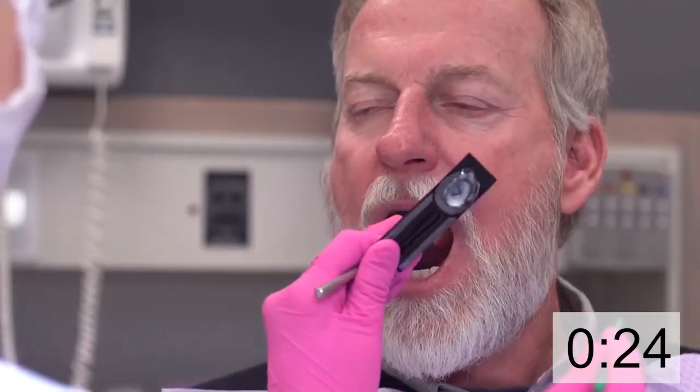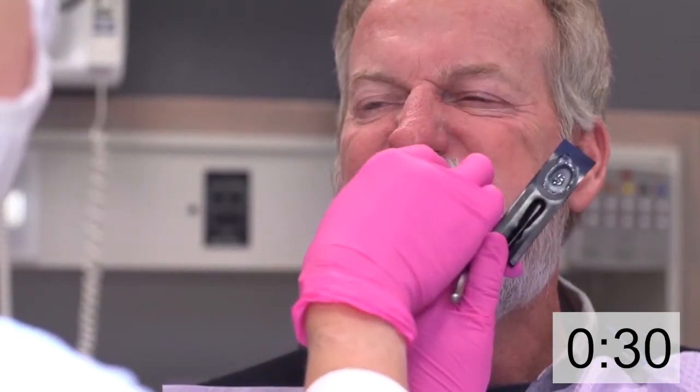I then retract the right cheek, reload my brush, and give it a nice swipe across the maxillary arch, reload, then swipe across the mandibular arch.